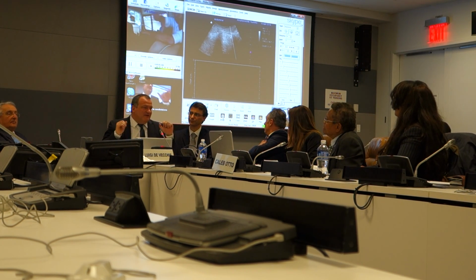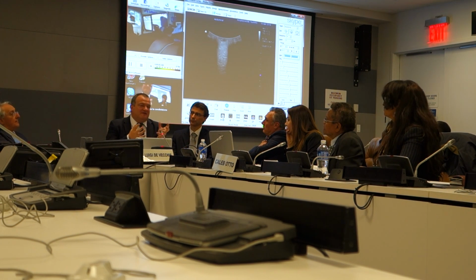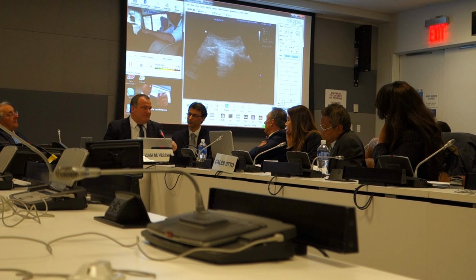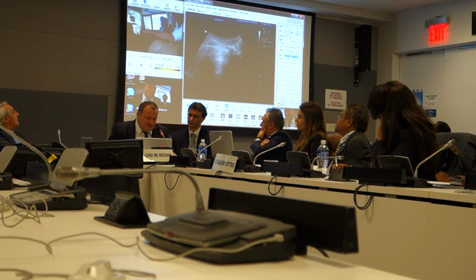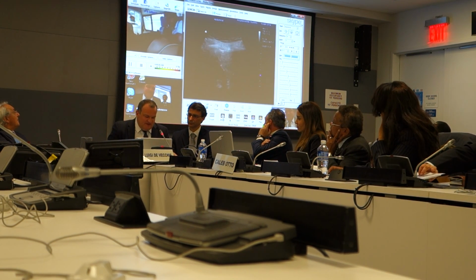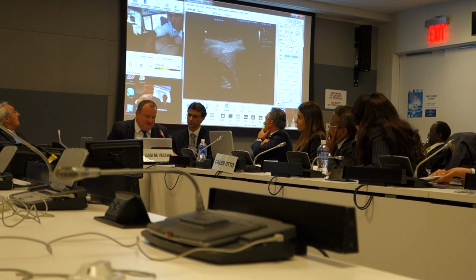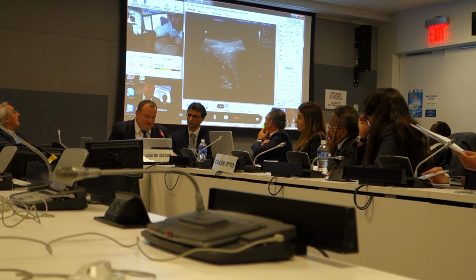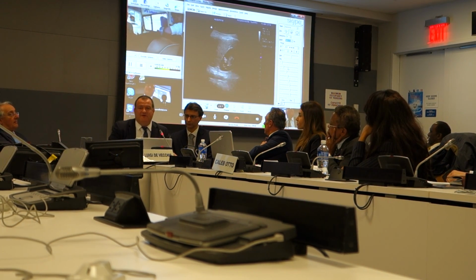In the meanwhile, he's sending me in native format the exam that, for medical legal purposes, I will have in my archive. So thank you for showing me this. Just show me an abdominal view around the spleen, for example. So here we'll have an image of the spleen. Here you see the kidney. I will look at these interfaces where I'm sure that there is no free fluid.